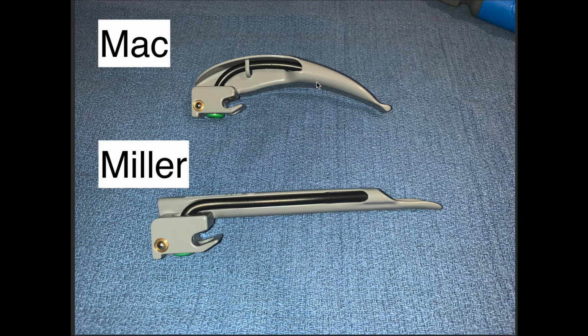Let's look at some videos. We're going to look at a total of 4 different laryngoscopy views. For this first one, we're going to take our time and pause periodically to highlight some of the anatomic structures. The subsequent 3 will be a little bit faster, just to review what we learned in this video. So here in our first laryngoscopy video, we can obviously see the patient has already been put to sleep.